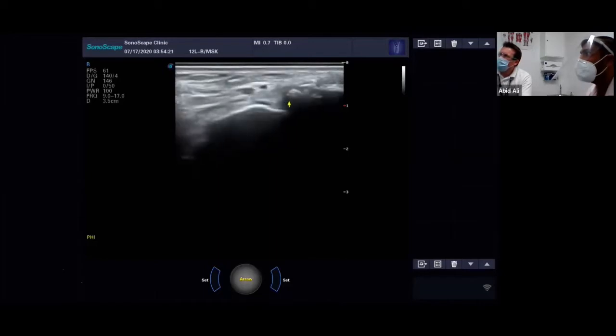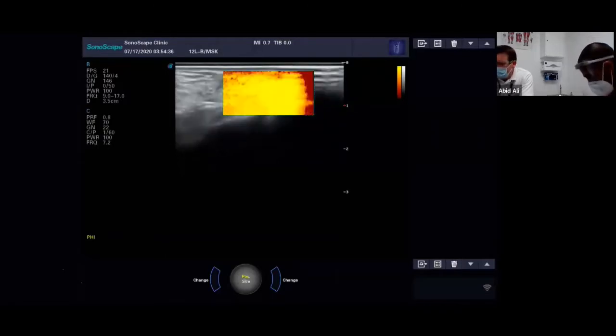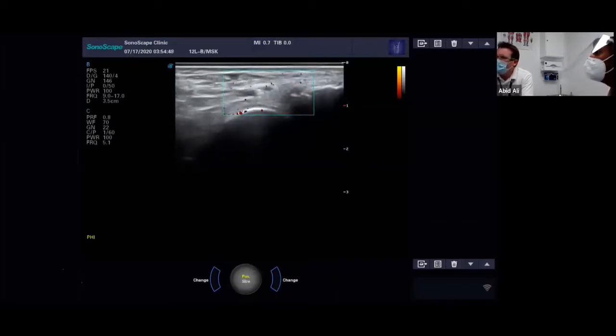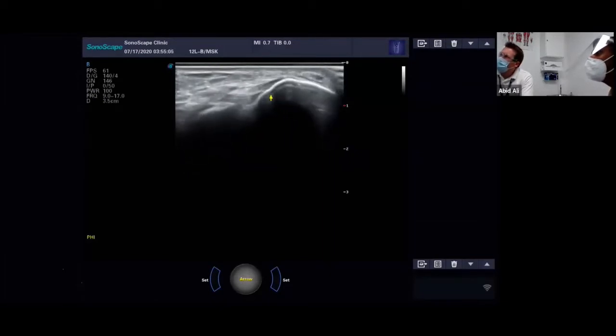We can see another, what's that? Is it a nerve or a little vein artery in there? Well, we can put the box on it and see if we've got any blood flow. Let's find out where this. There you go. So it looks like it's probably a vein and a nerve. Yeah. And see how close it is to that tip of his fibula where we'd find the ATFL. Just find some fibers off.